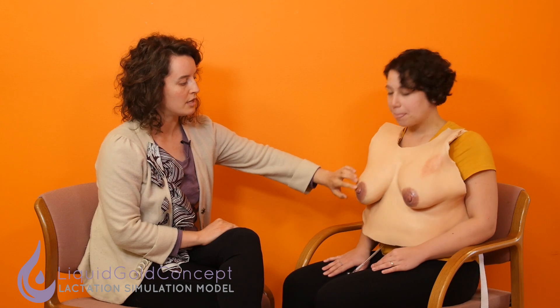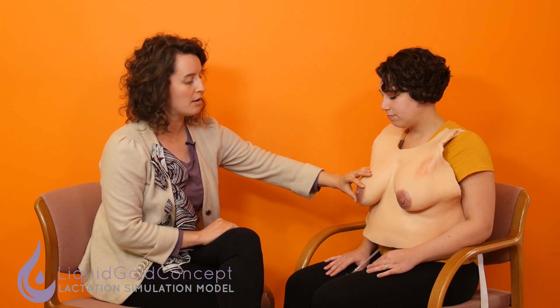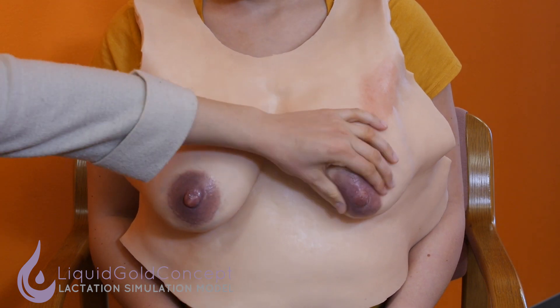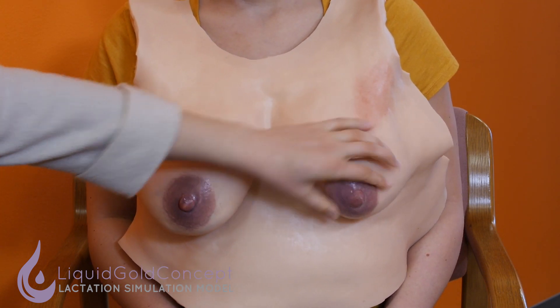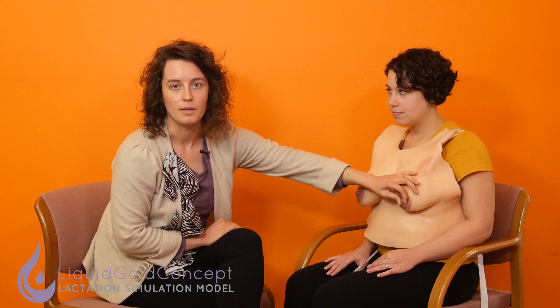On the Essential LSM we have a round nipple and a slanted nipple. These nipples are really great for teaching your learners about the different kinds of latches. A round nipple is what you're going to get if the baby had a deep and correct latch. A slanted nipple is what you're going to see if the baby was chewing just on the nipple and having a shallow latch. We really wanted to represent these common features in our basics of breastfeeding LSM, the Essential.